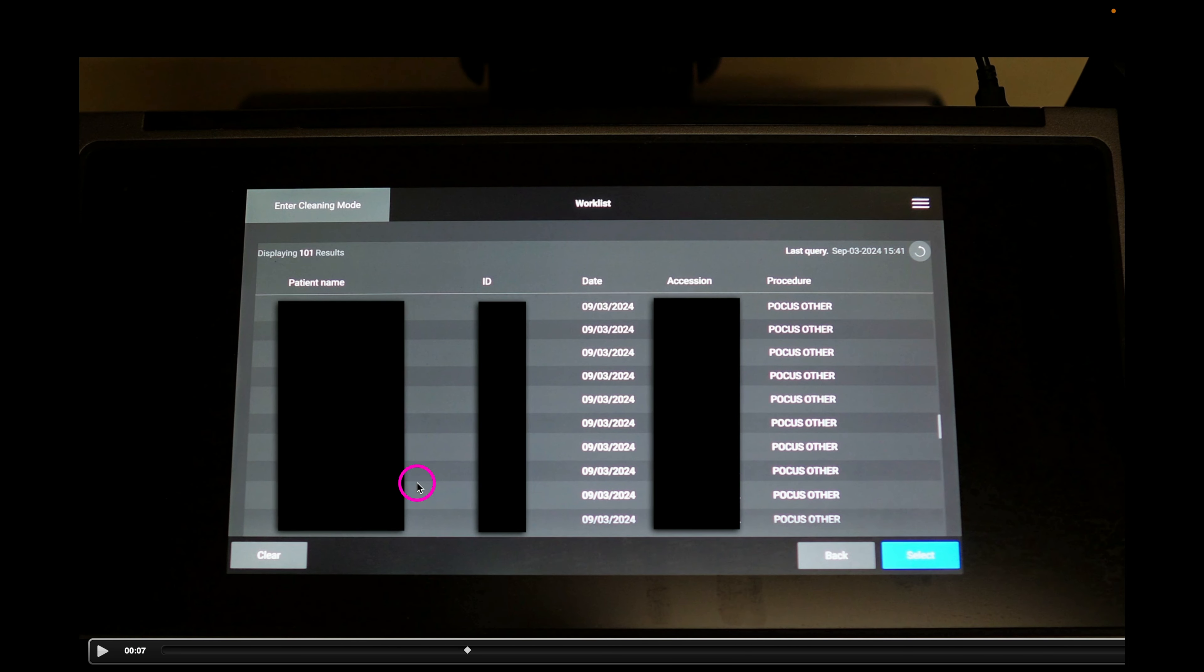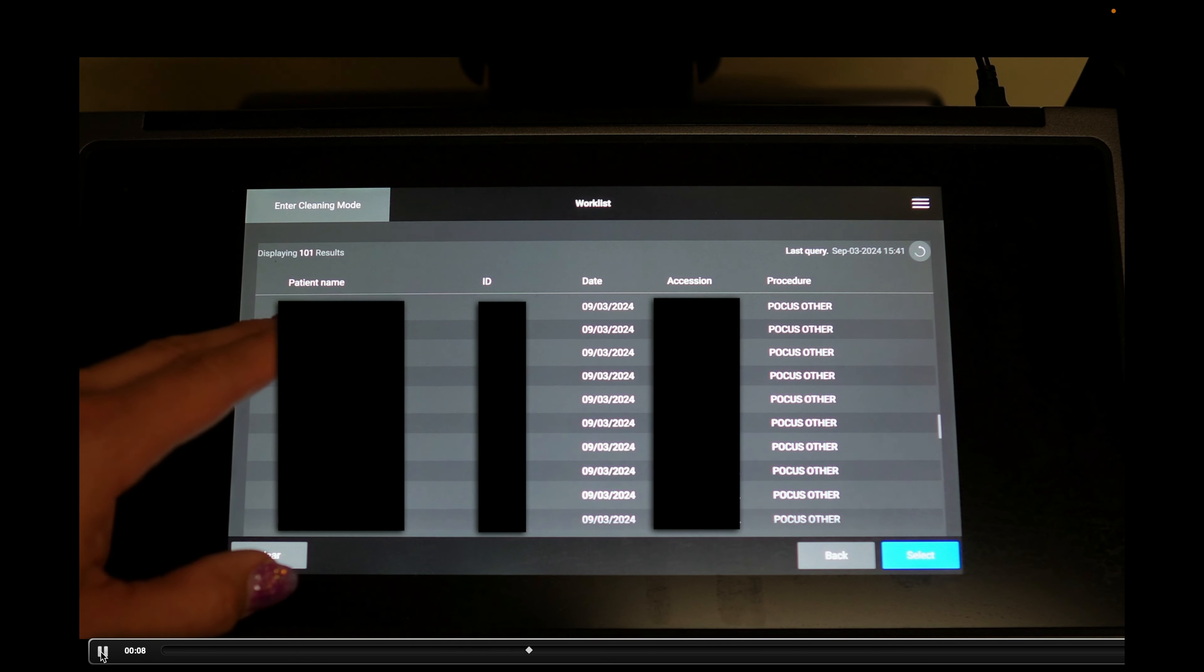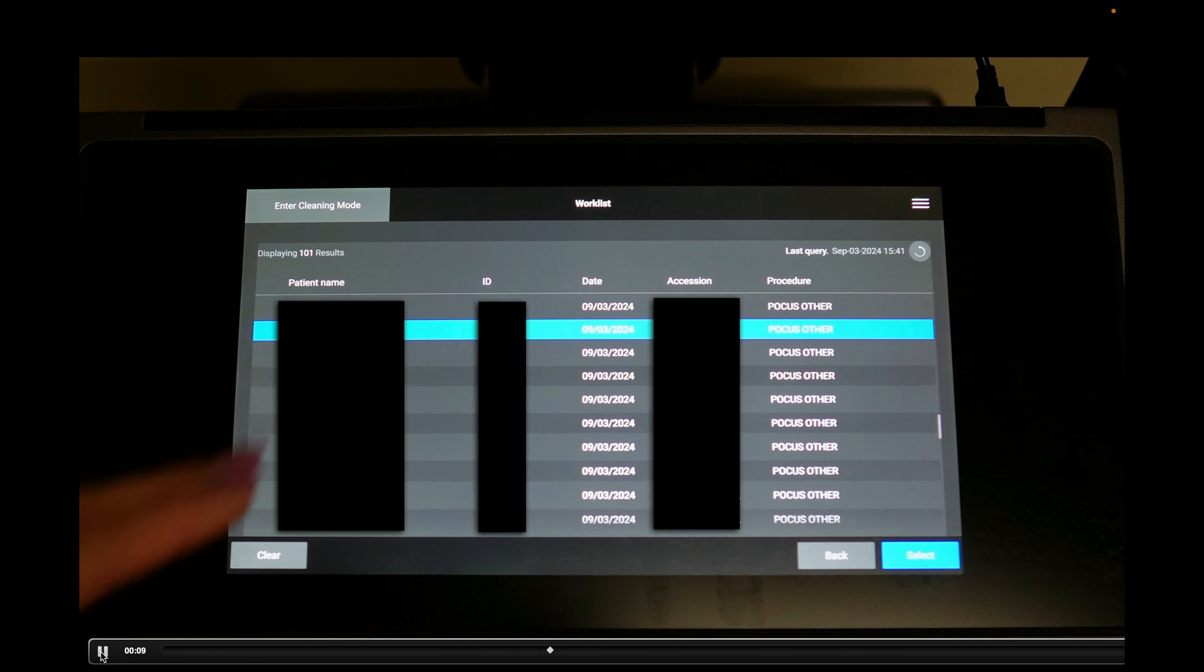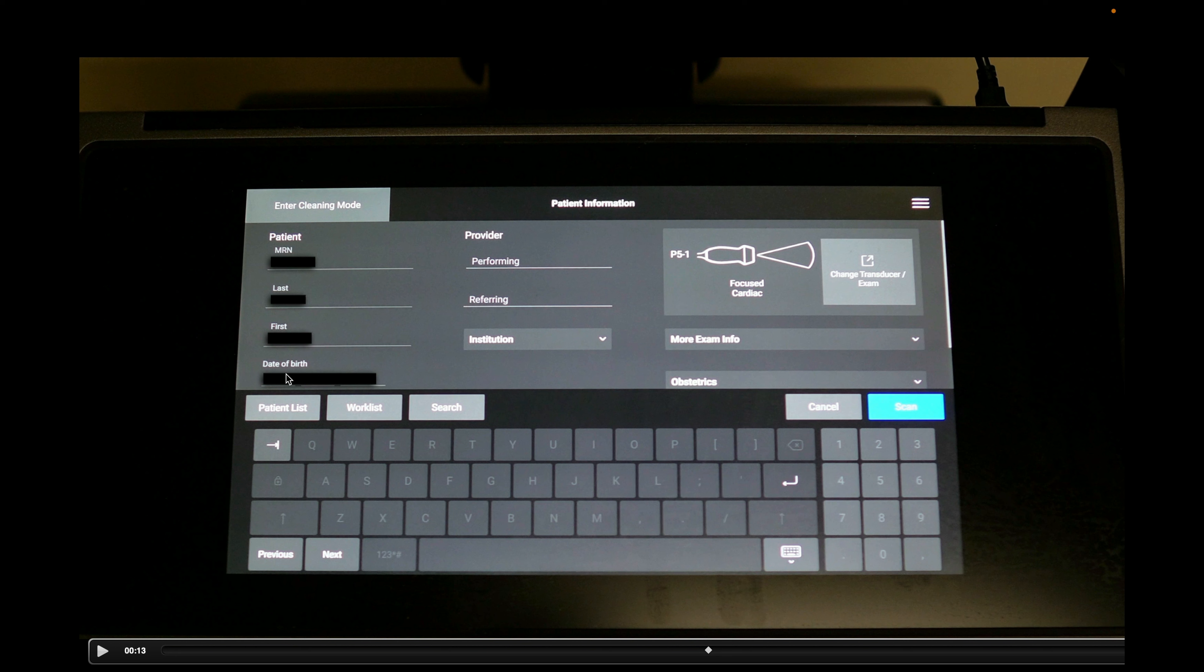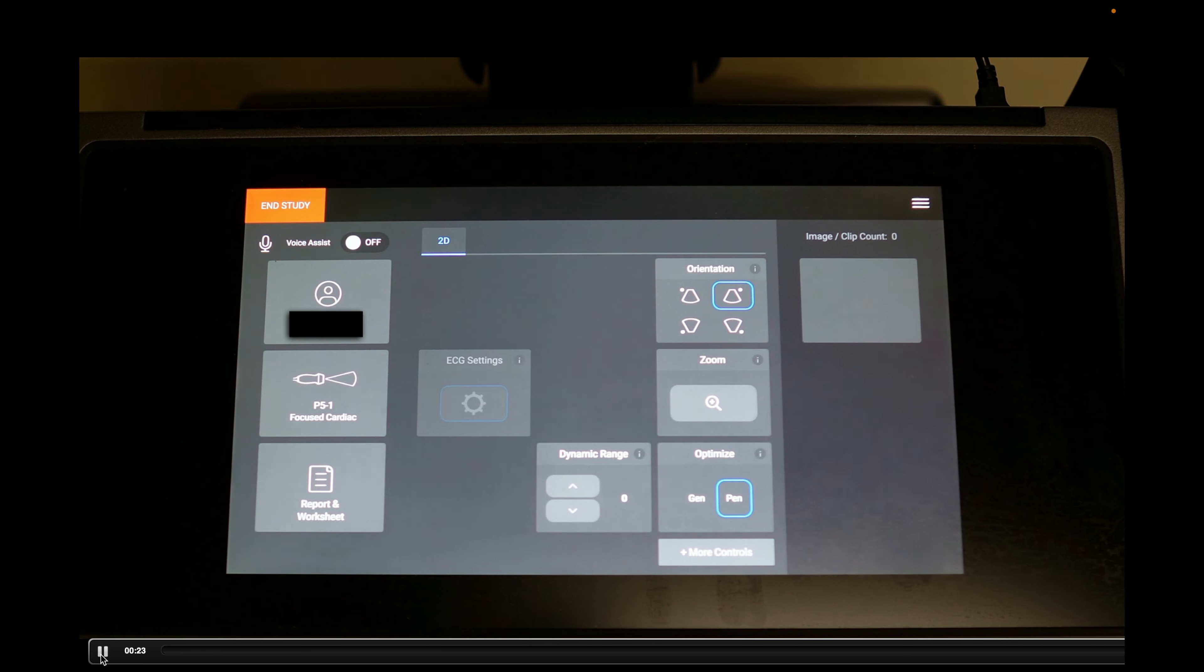Now, if we see here, I have these black bars here for patient privacy, but each of these are patients that would be in your department. You're going to select whichever one you want to start the exam on, hit select, and then the patient's information will show up in these areas. Now you want to put your user ID or your initials on the examination. You're going to select the performing and put in whatever identifier you want for yourself, and then hit the scan button and you're ready to go.